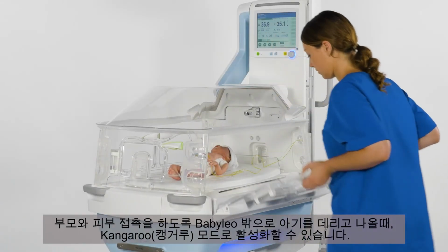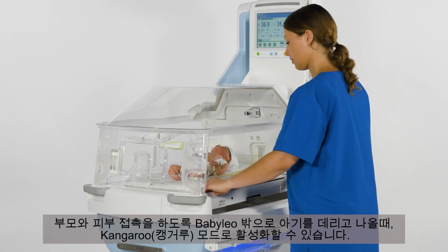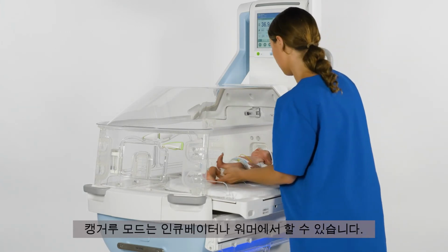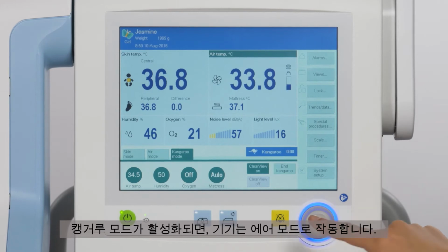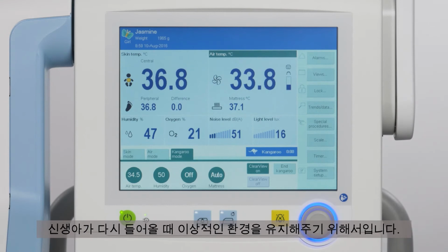When the baby is taken out from Babyleo for skin-to-skin care with mum or dad, the Kangaroo Mode can be activated. Kangaroo Mode can be used during incubator operation and radiant warmer operation. Once Kangaroo Mode has been activated, the device is operated in air temperature mode. The settings for air temperature, humidity, oxygen, and mattress are adopted from the previously set therapy parameters to ensure an ideal environment when the infant is returned.